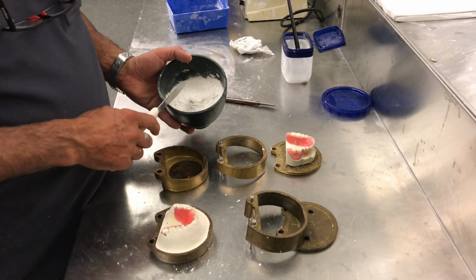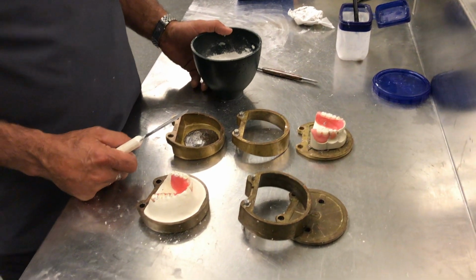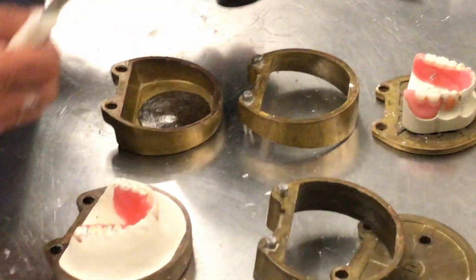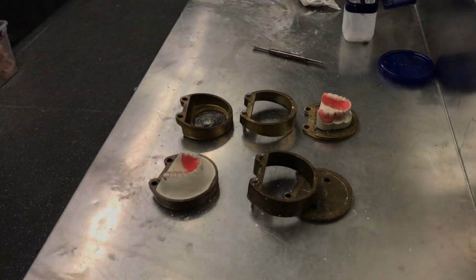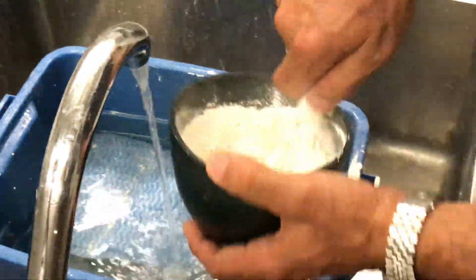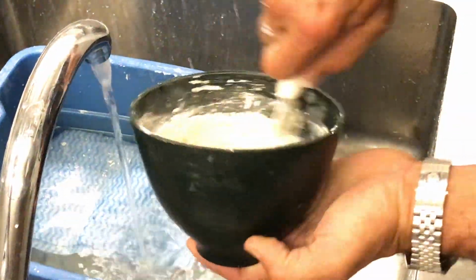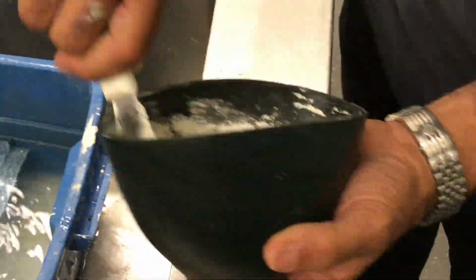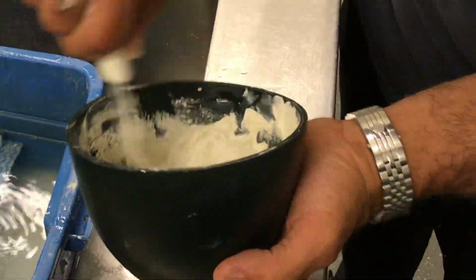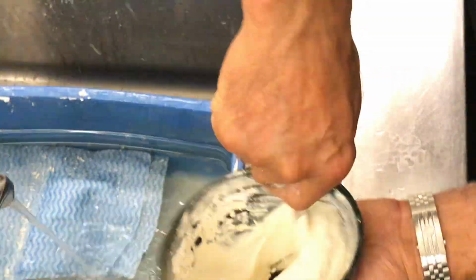Okay, so now we have some more 50-50 plaster stone mix, and we're going to start investing our lower case. I'll just add some water to this. Again, we're looking for a somewhat creamy consistency that, upon final spatulation, the mix holds its weight.